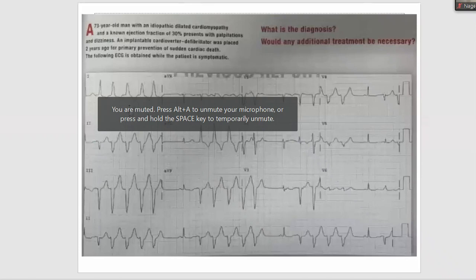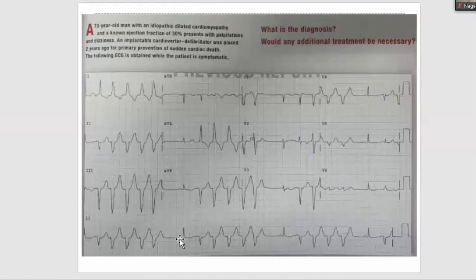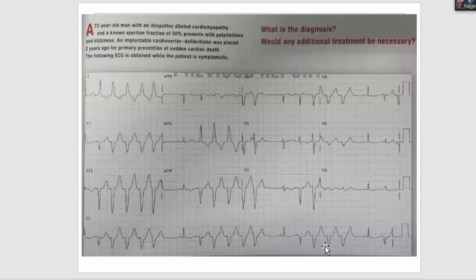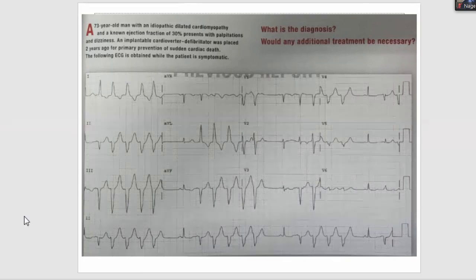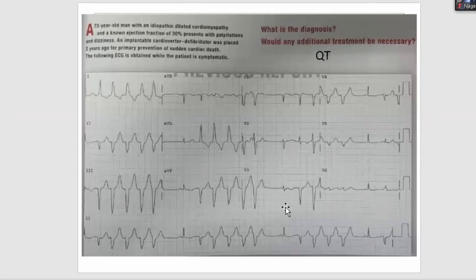This ECG doesn't appear to be sinus rhythm — no one would agree this is sinus. There is one sinus beat, and the second part of the ECG shows a non-sustained VT, or couplets or quadruplets of ventricular beats. Whenever you see such ECGs in dilated cardiomyopathy or heart failure patients, look for any clues in the ECG that may be causing these VT episodes.